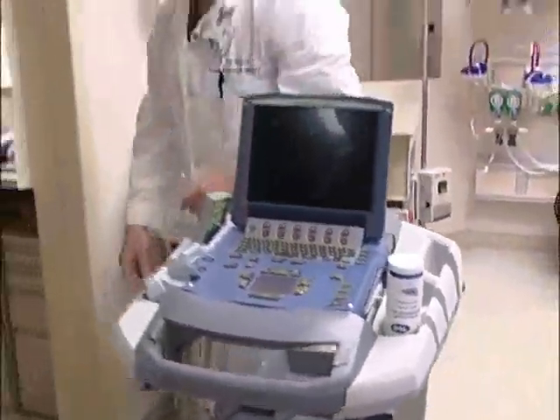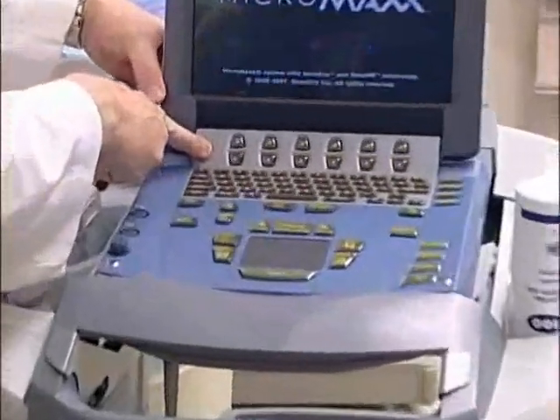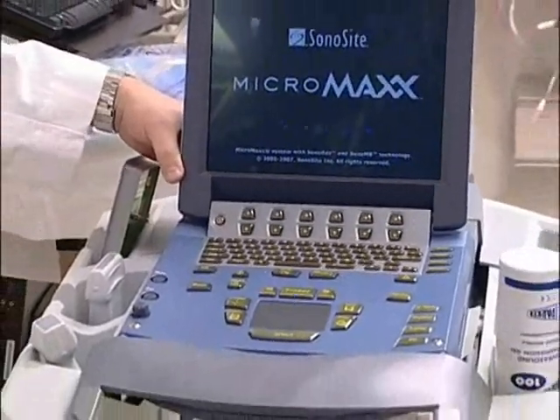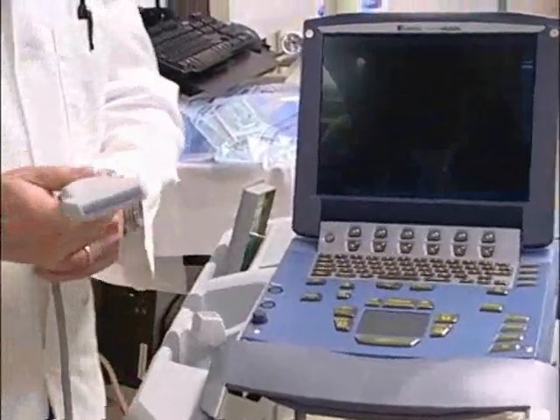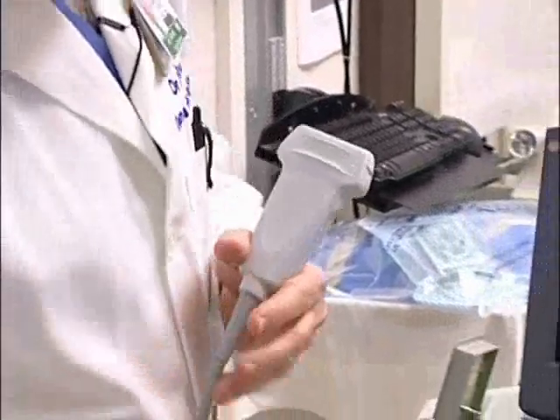The ultrasound machine is turned on here with the power button. The machine, when turning on, will go through a self-test procedure. For central line insertion, the proper probe is the linear probe. The probe is attached to the bottom of the ultrasound machine here.